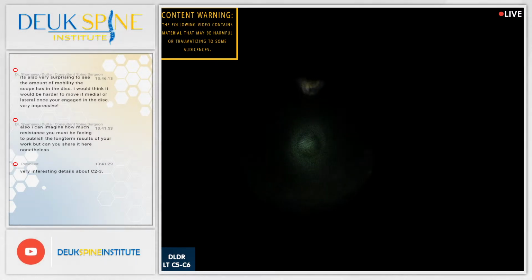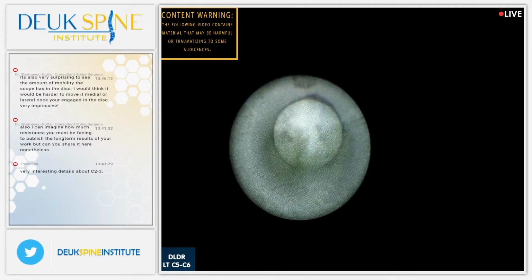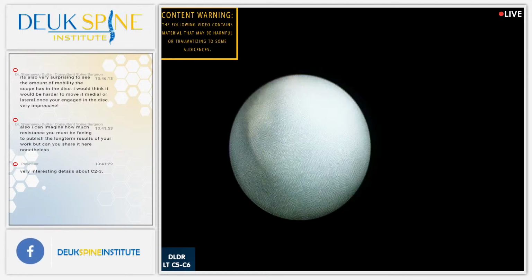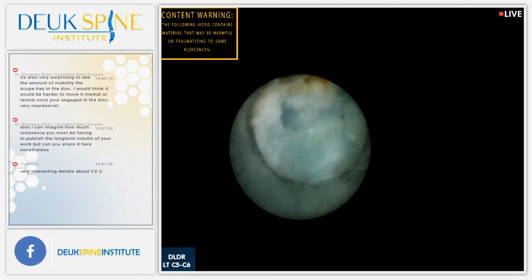Let's flip it one more time. We have irrigation or no? Yes. All right, I'm just about done. Go ahead and type your questions and I'll come answer them for you face to face.